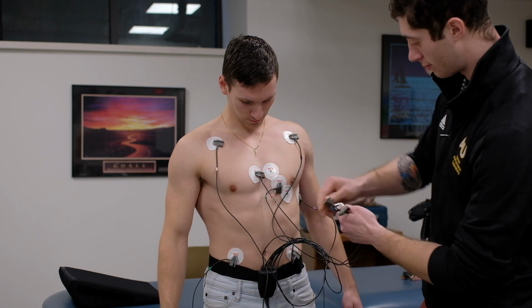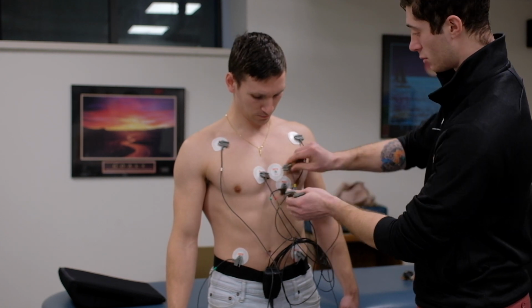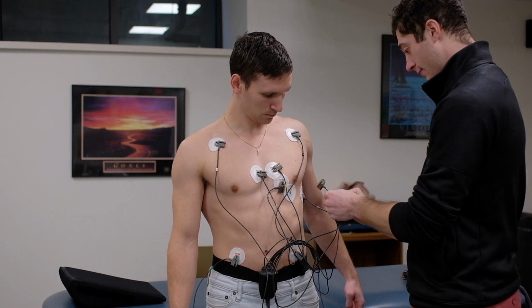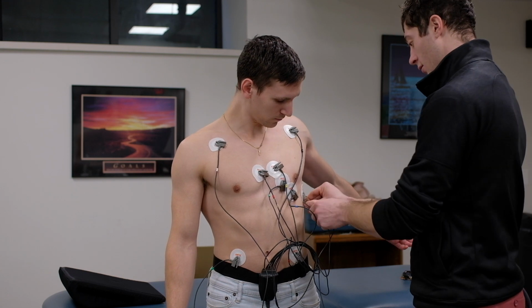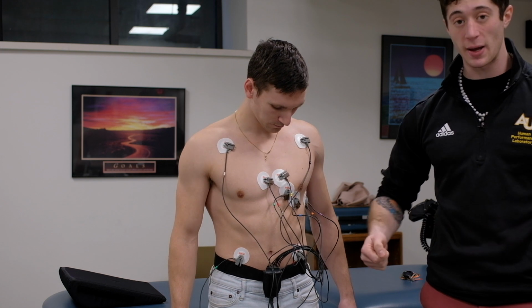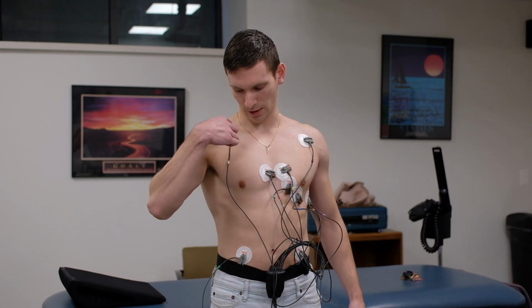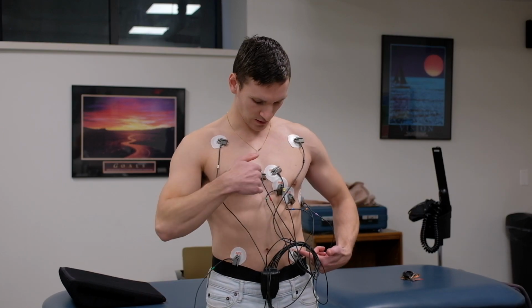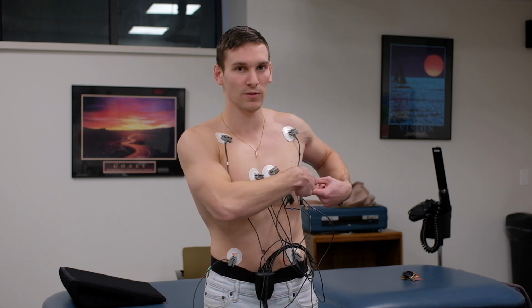V1. V2. V5. Actually, this is V4. And V5. Once you've gotten all of these on, you can then take an ace bandage and wrap it around. So we've got right arm, right leg, left arm, left leg, V1, V2, V3, V4, V5, V6.